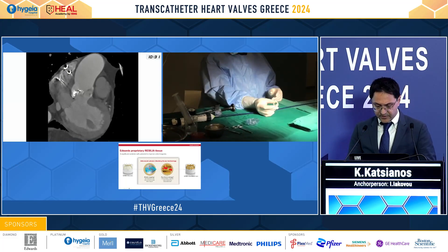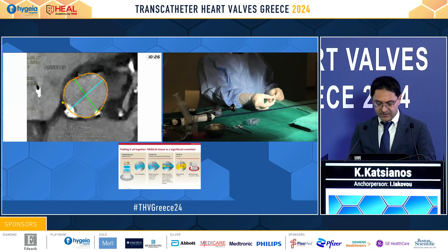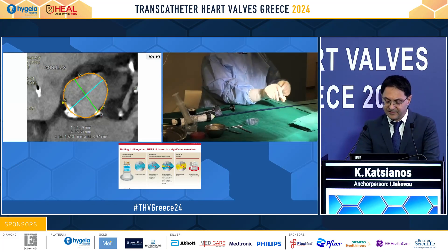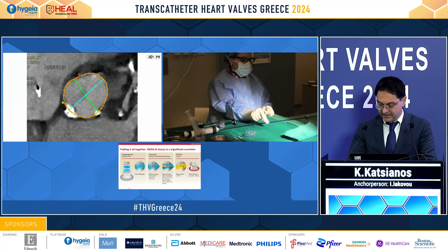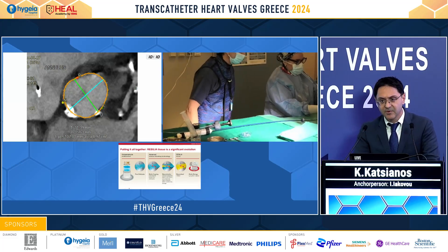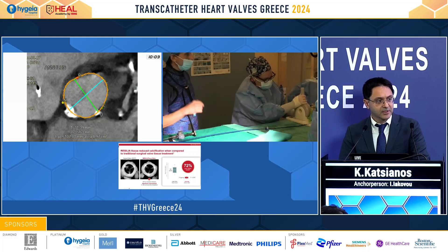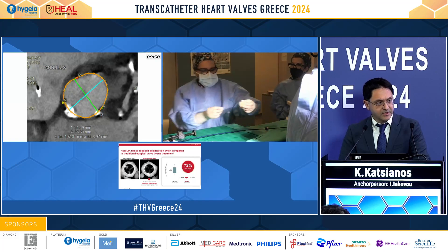Moving on with our case, we see the heavily calcified bicuspid aortic valve with a large annulus — diameter of 31 to 35 millimeters and an area of 8.97 square centimeters. Maybe we should ask the colleagues now for their thoughts. We have a bicuspid valve, heavily calcified, with a very large annulus.